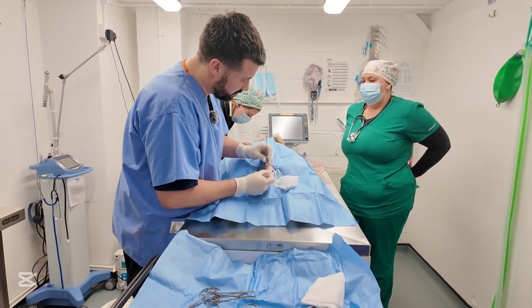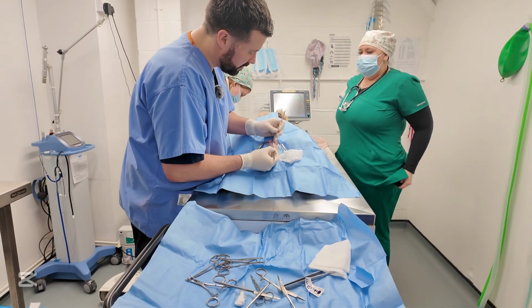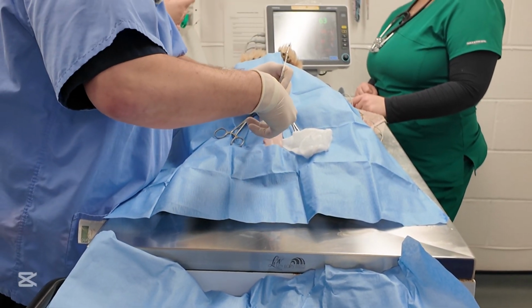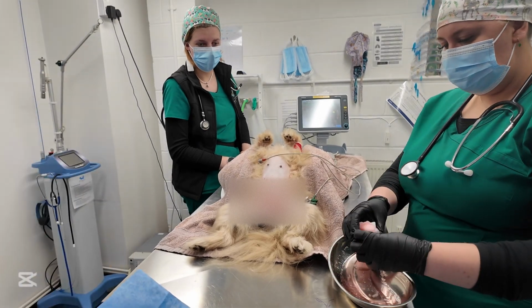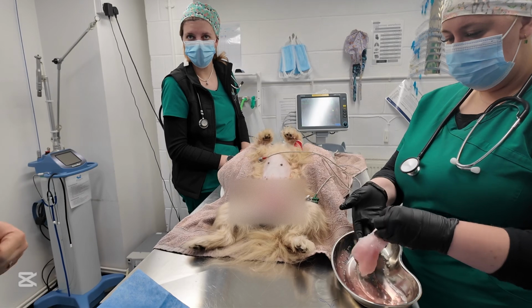Lift that muscle layer on the midline. Make an incision through something called the linea alba, which is the joining point, if you like, between the two abdominal muscles. After the surgery, Karian cleans the area where Richard operated.